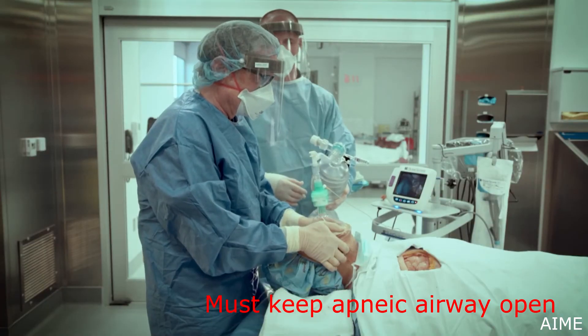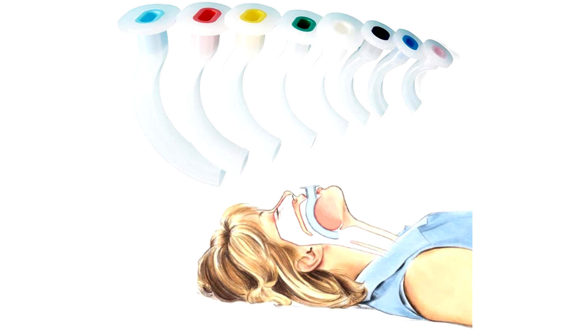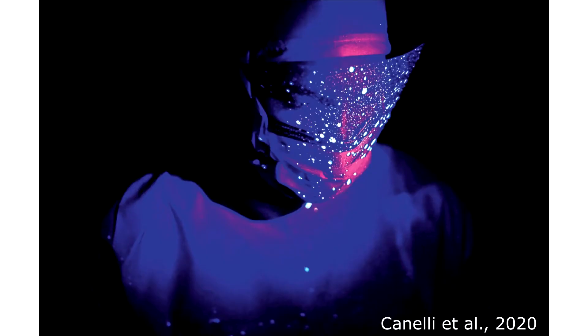If you're having difficulty maintaining a seal — for example because of a beard — you can take some muco and put that in the beard to help your seal. You can also take a large tegaderm, cut a hole in it for the airway, and put that over their face. You may think about putting in an OPA to facilitate the open airway, but in the days of COVID this isn't recommended because if they're not fully paralyzed, they may cough on you.